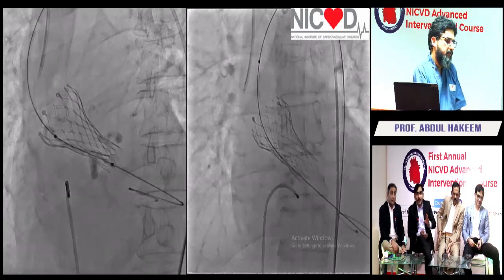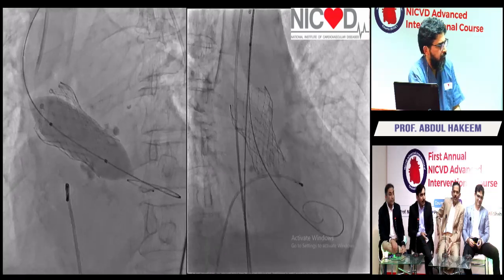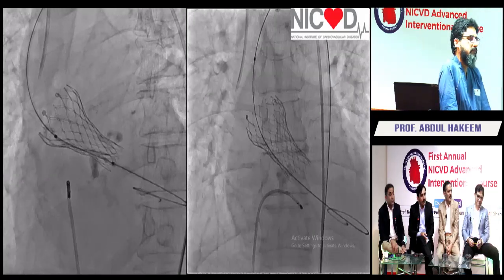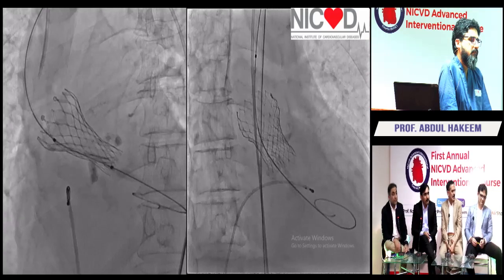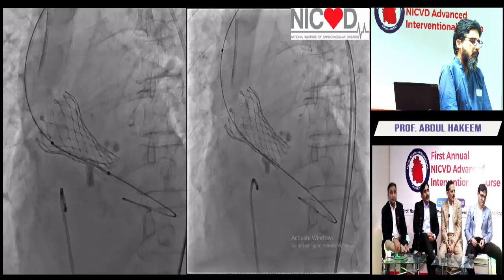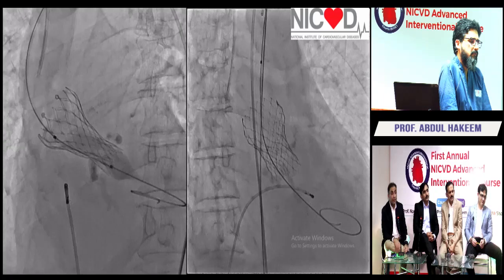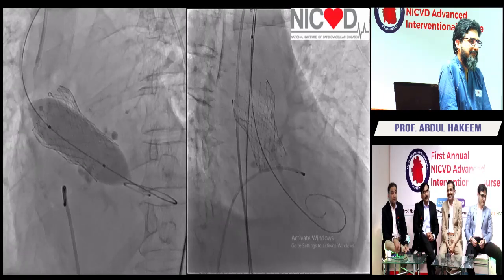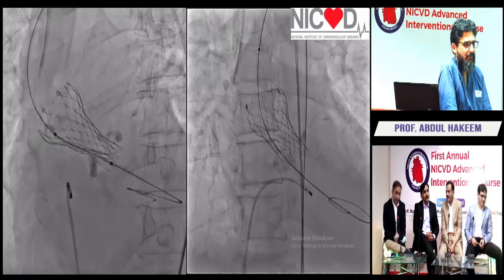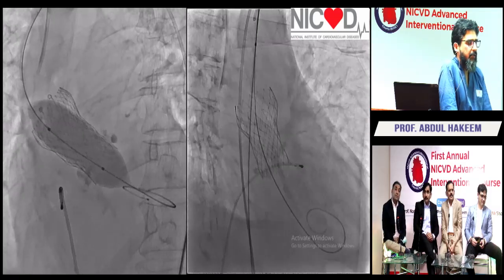So sometimes if the aorta is dilated, we have seen people use it. We have seen people show some cases, especially in TCT, where they have used a similar kind of valve in the venous system just to control significant TR or something like that. I don't know. Sir, I would say that you have to snare this first. I'm telling, beyond this STJ junction, just above it, and then put another valve so that there should be a space between them, so that the flow to the coronary should not be compromised. Yeah, see, what you have to understand is this.